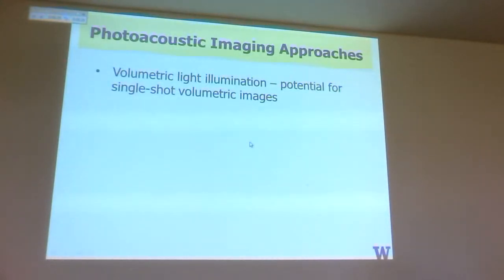And then, what can you do with the ultrasound? Well, exactly the same thing. The largest possible aperture that you can. So you have a spherical aperture around that. Right? So you have a lot of light sources, and you have a lot of ultrasound sources. And then it's really simple. So I'm not going to show any diagrams for this one, because it's pretty simple. You pulse on a big light that comes in from all the fibers all the way around. That's time t equals 0.